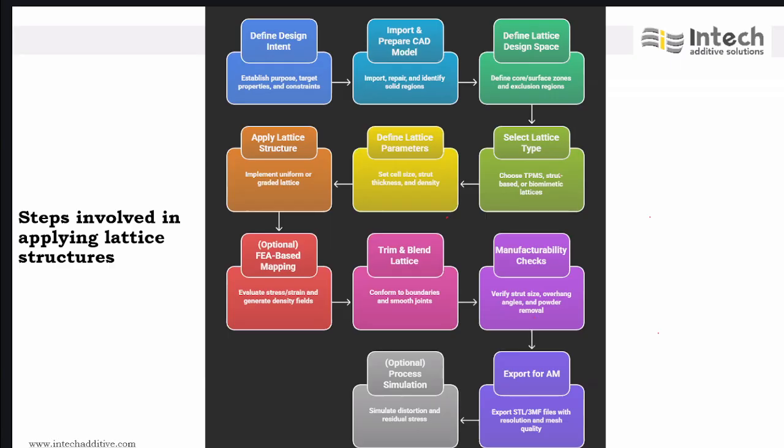Like it's defining the core or surface zone. And also you have to define the exclusion regions, where you don't want things to be latticed. Those exclusion regions we define.